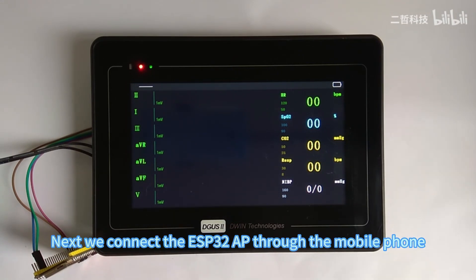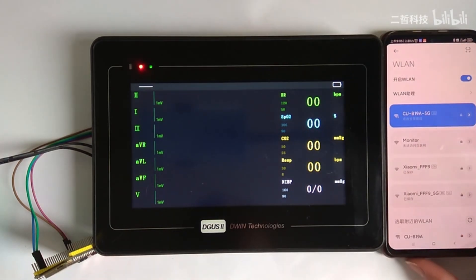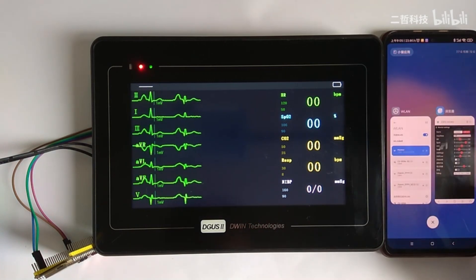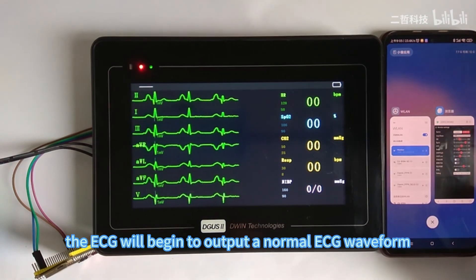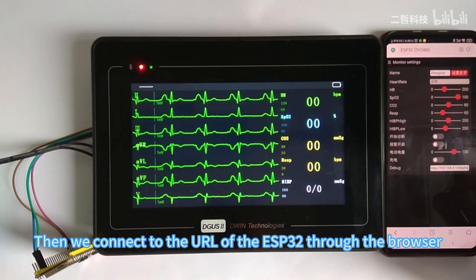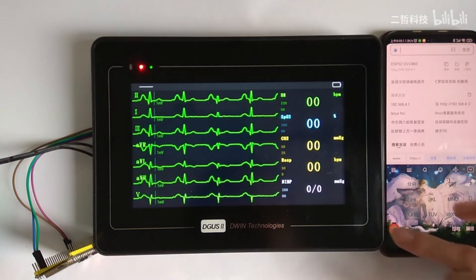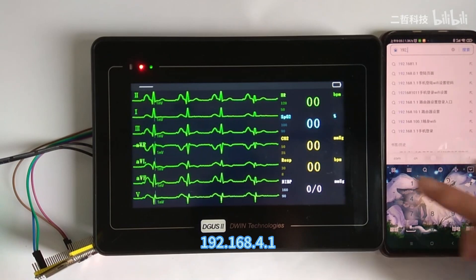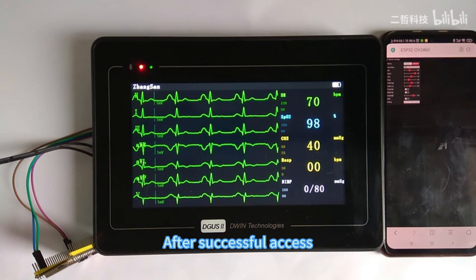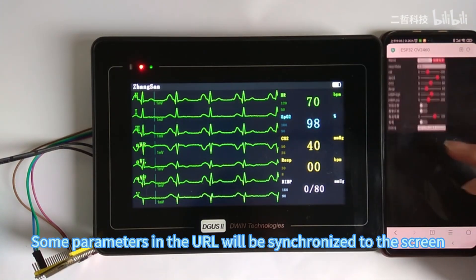Next, we connect to the ESP32 AP through the mobile phone. After the connection is successful, the ECG will begin to output a normal ECG waveform. Then we connect to the URL of the ESP32 through the browser. After successful access, some parameters in the URL will be synchronized to the screen.